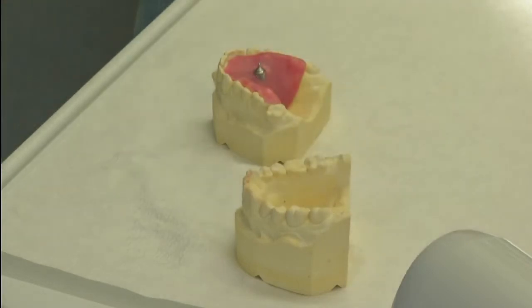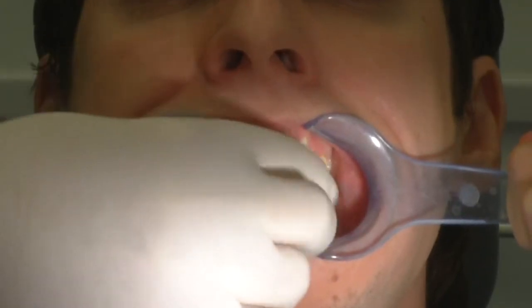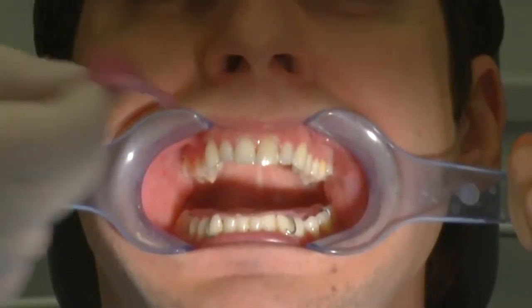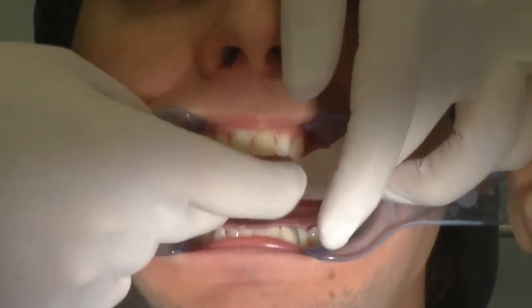The mandible and maxilla templates, prepared as described in the processing instructions, are checked to ensure they fit properly. The support pin of the maxillary plate is adjusted until there is no contact between the upper and lower rows of teeth during movements.